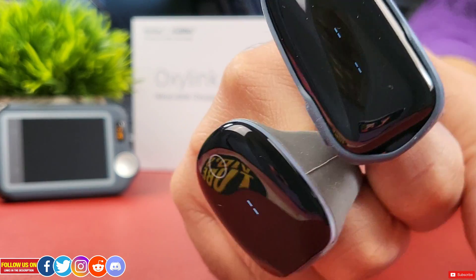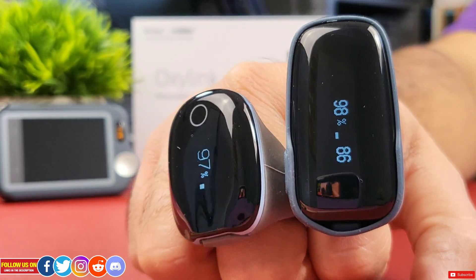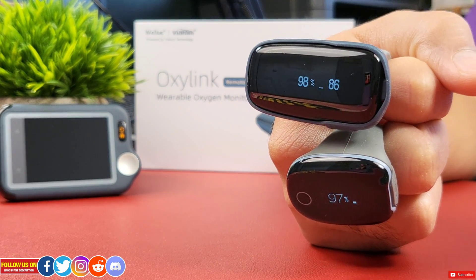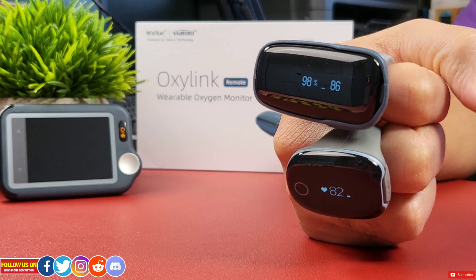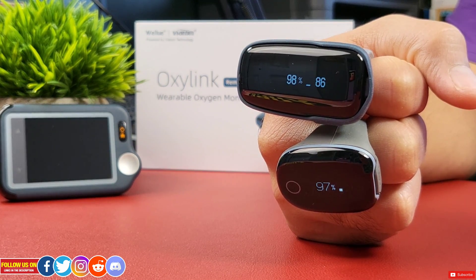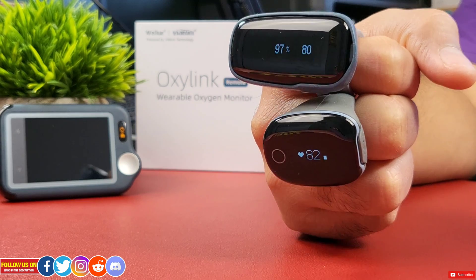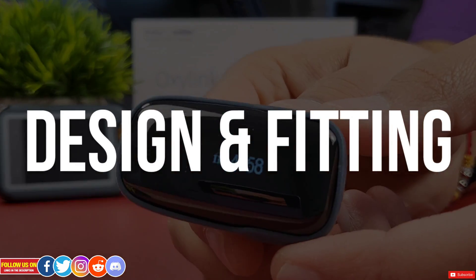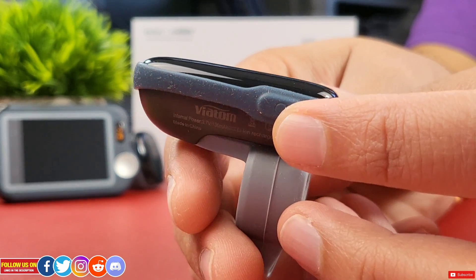From my testing and comparison of the OxaLink to the O2 Ring, the measurements are on par — they are both about the same and accurate. I personally find the OxaLink a bit too bulky to wear, especially after using the O2 Ring, but I think you'll get used to it after a few nights.